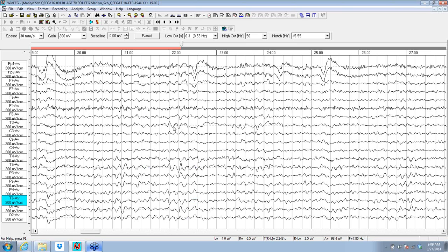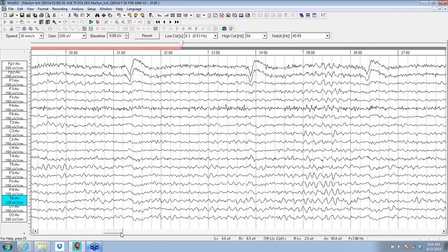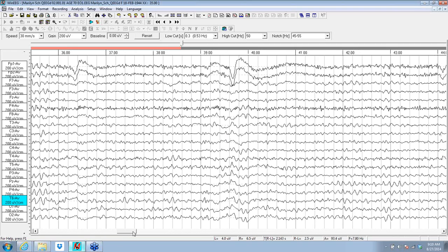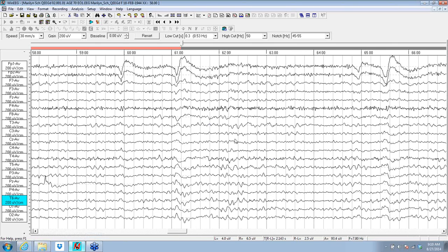So one of the things in EEG, when you see a slow wave or two and then they go away, this is a clinically significant pattern. And in our laboratory, if the doctor sees this and it's written up, these findings of intermittent temporal slow waves that are independent like this, they're not persistent. If this was an ongoing, always there slow wave in the temporal area, that's a focal slow wave. But what we have here are bitemporal transient slow events.